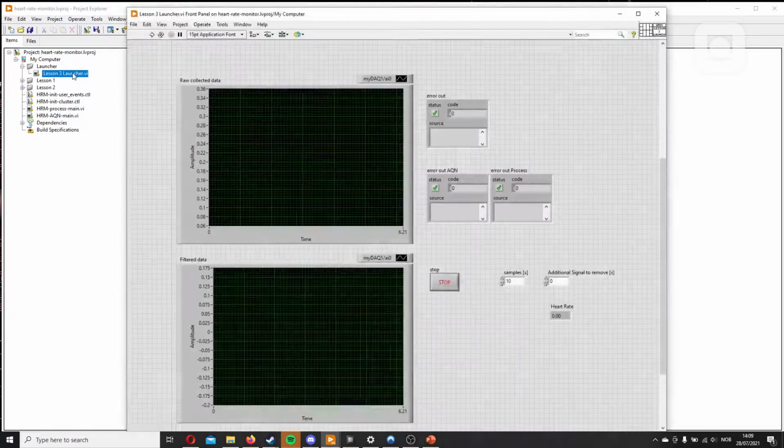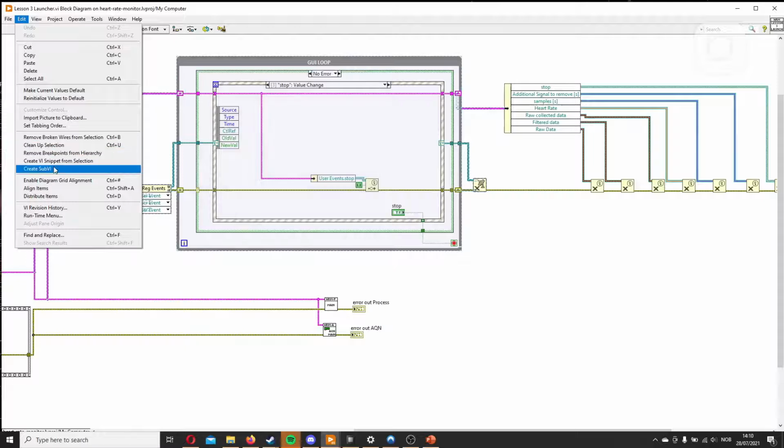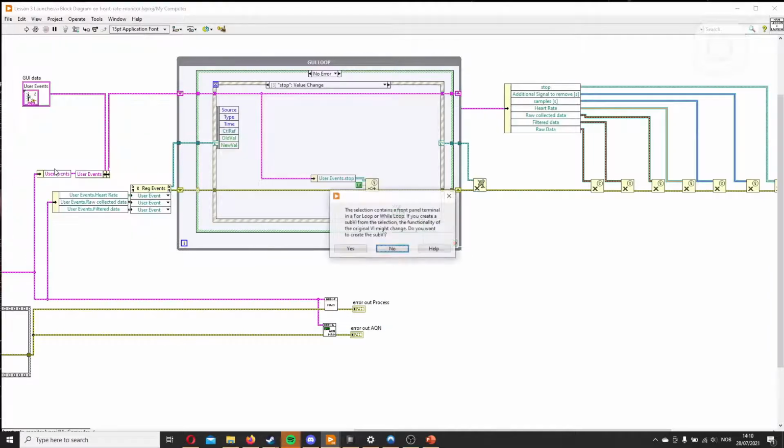We'll just start up where we left off, and this time it's this part which needs to go in. I can show you what happened. If I press create sub-VI now, we will get this: the selection contains a lot of front panel terminals, for loop, and so on. So the functionality will change, which is what I showed you in the last video. So I won't go into it, but this won't work.